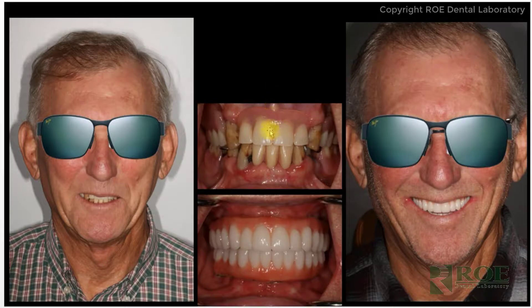This particular patient presents with upper and lower partial frames. There are metal clasps on the patient's lower partial, which will not pose a problem because we use the casts for articulation, not the CT scan. So we don't really worry about scatter with minor amounts of metal.